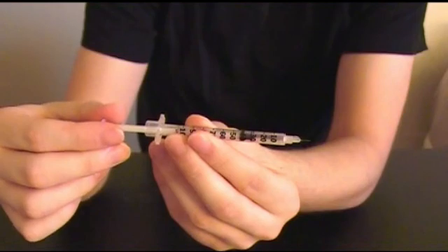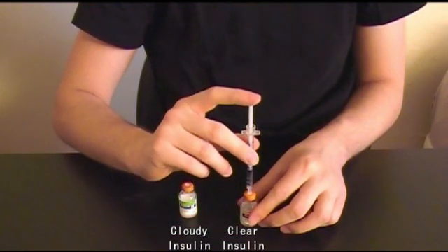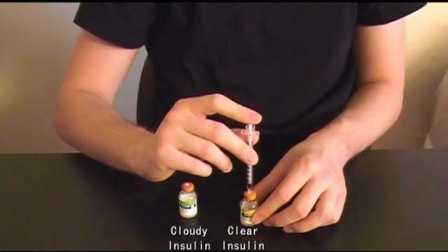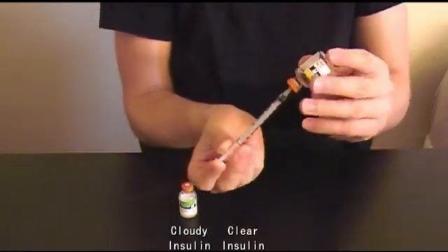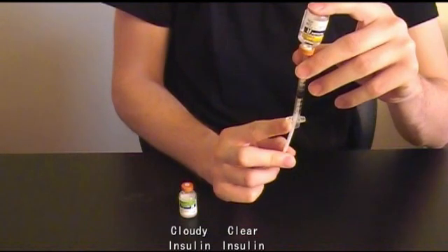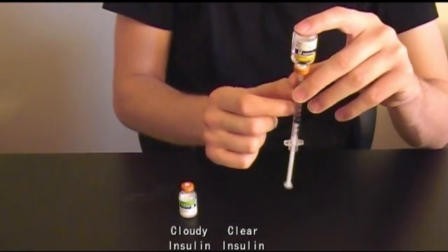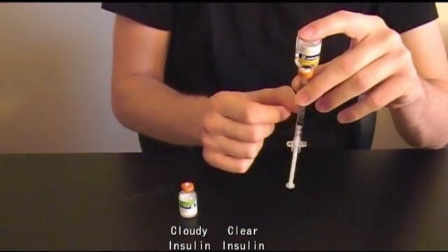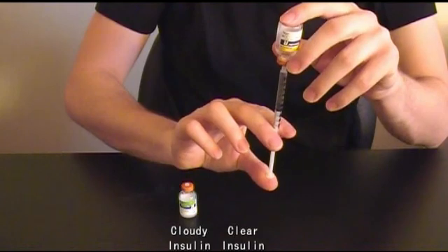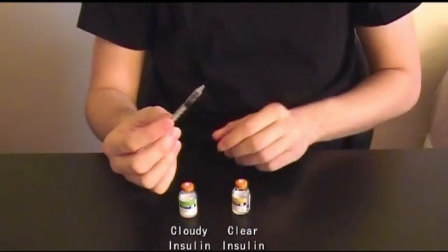Next, pull back the plunger to the amount of clear insulin you are going to inject. Insert the needle at 90 degrees into the clear insulin vial. Push the air into the vial and gently flip the vial upside down and pull back on the plunger to remove insulin from the vial. Pull back past the number of units of clear insulin needed and gently flick the side of the syringe to force any air bubbles to float to the top. Air bubbles won't harm you, but they are taking up space that should be your insulin. Now gently push the extra insulin back into the vial and withdraw the needle.